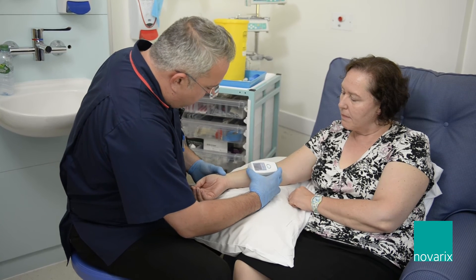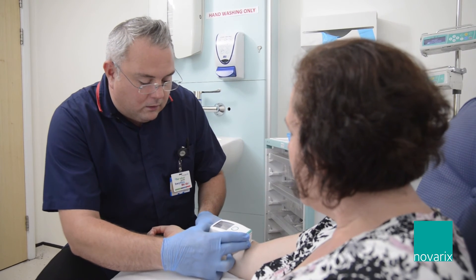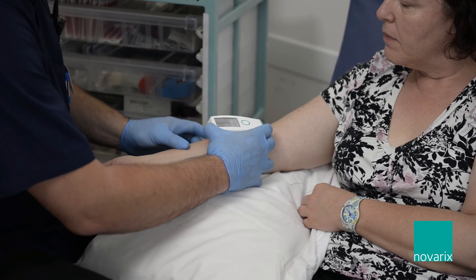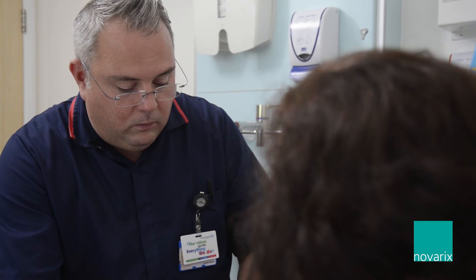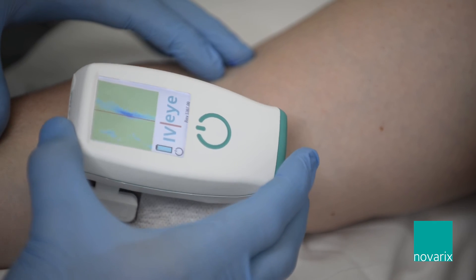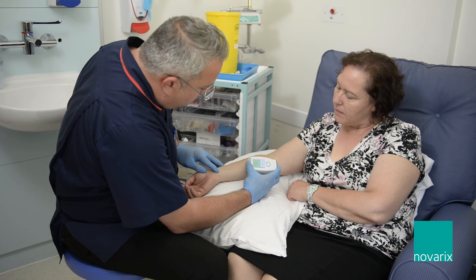In some cases you can use the IVI in real time. If you've got a nice strong length of vessel, you can insert the cannula just before the device where the light shines. But you must make sure you put a sterile probe cover of some description over the IVI.